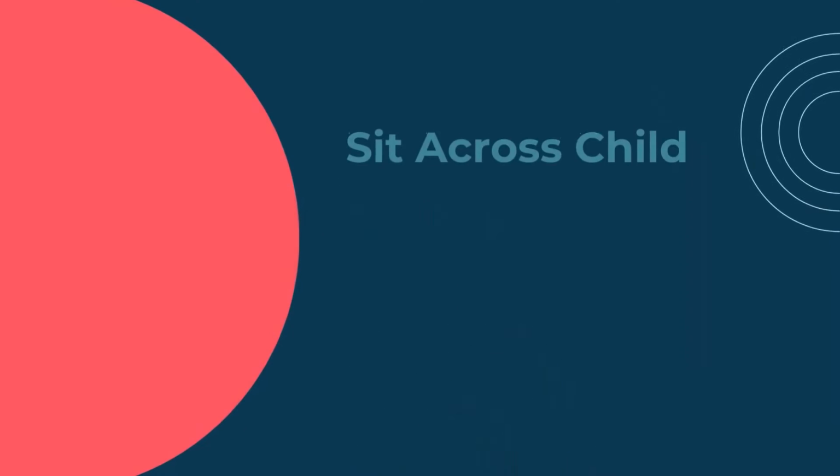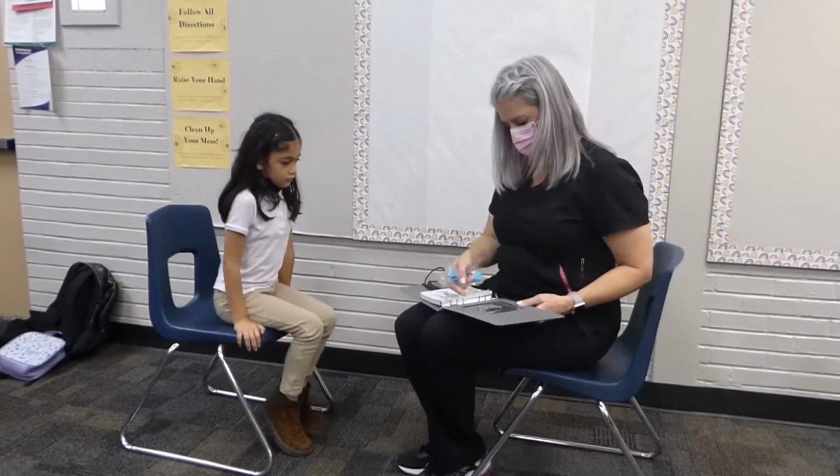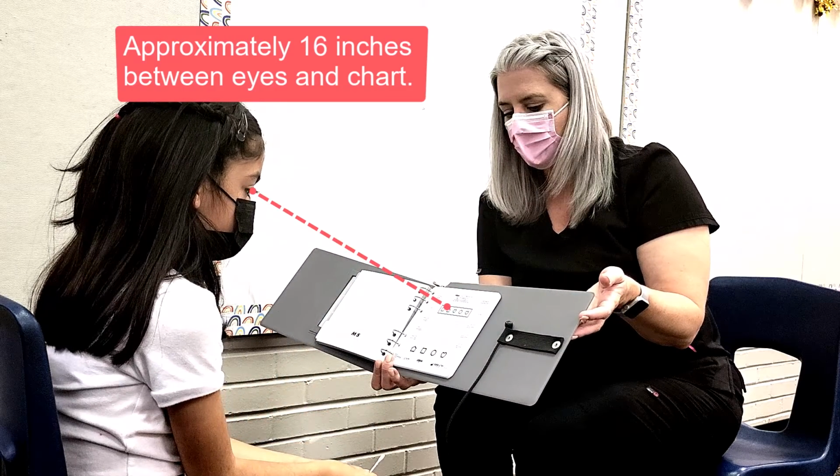First, the screener and the child will sit across from one another in chairs. Ensure that the child is 16 inches away from the chart by using a measurement tool. Use the measuring device that comes with the chart to measure the appropriate distance from the child's eye.